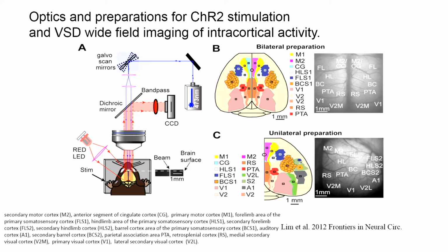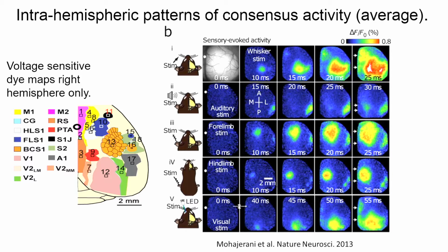So to assess cortical functional connectivity after stroke, we built a system where we could measure functional connections using light, using voltage-sensitive dye imaging, and at the same time stimulate channelrhodopsin. And the best combination when we started these experiments was to use channelrhodopsin for the photostimulated opsin, and then the organic voltage-sensitive dye, RH1692, to read out activity. And the idea is that with a laser, we can activate a particular cortical point, and then using the imaging, we can read out connection strength with that point. And we wanted to do this to look at how the brain changed after a stroke.